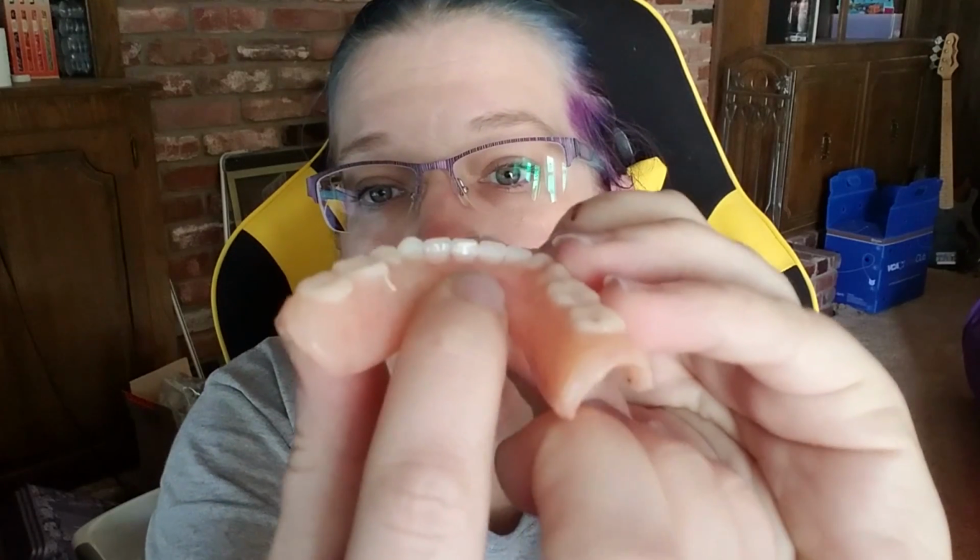Now, there's a method to eating with your dentures in without using glue, and that's to stick your tongue at this point right here where your teeth meet up with the base of your denture, and push down on it or push forward with it to keep your choppers in place while you chew. I've been doing some of that for the entire time that I've had my immediate dentures, but I'm going to see if I've mastered it yet.